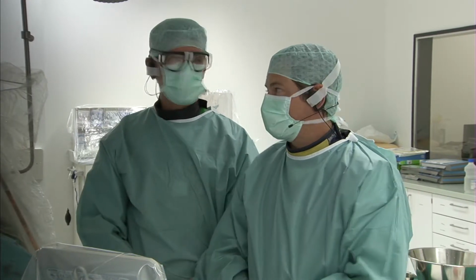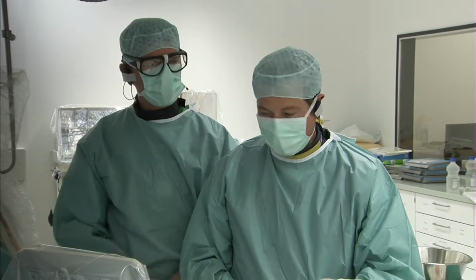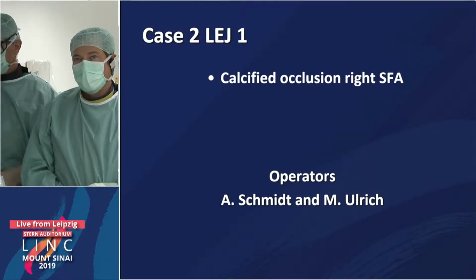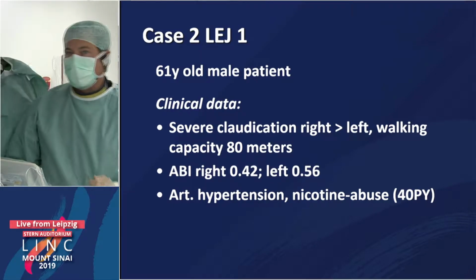With me is Matthias Ulrich from our lab. We can right away start with our first case. Maybe Matthias, you can introduce the case. Of course, yes. So we have a male patient. Next slide, please. We have an occlusion of the right distal SFA artery.